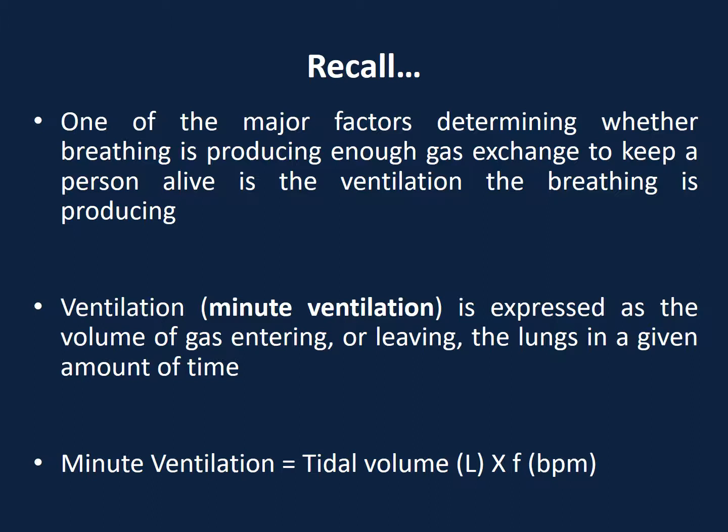So one of the few points to recall or remember is that one of the major factors determining whether breathing is producing enough gas exchange to keep someone alive is the ventilation the breathing is producing. And we will need to monitor that breathing through what we call ventilation or minute ventilation, which refers to the volume of air that is entering or leaving the lungs in a given amount of time. And for that, the formula for minute ventilation is the product of tidal volume and respiratory rate, sometimes referred to as F. Okay. And the units for minute ventilation will be liters per minute.